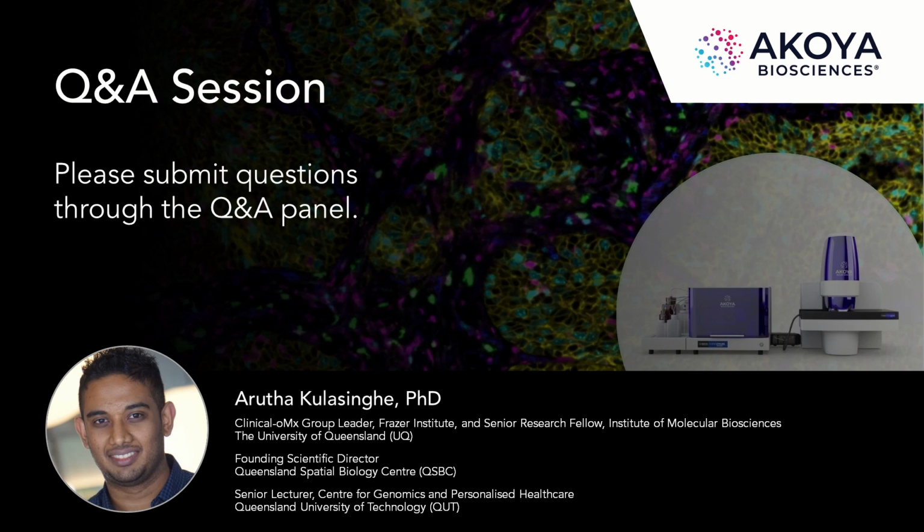I don't think we have a clear cut approach at the moment, but it's this confidence level before we call them. We were talking to some colleagues the other day and they were telling us that on DAPI they could call lymphoid-like aggregates. So I think if you have these B cell-like aggregates together, we can start to label them lymphoid, lymphoid-like, tertiary lymphoid-like structures, and then as you molecularly characterize them, we'll be able to define them better.